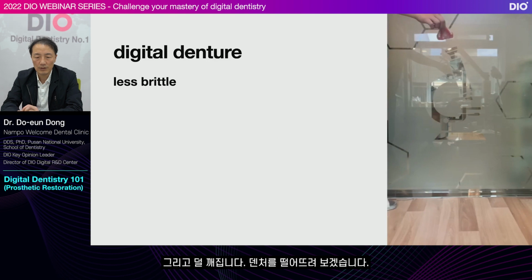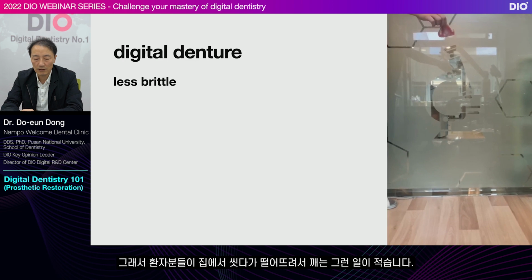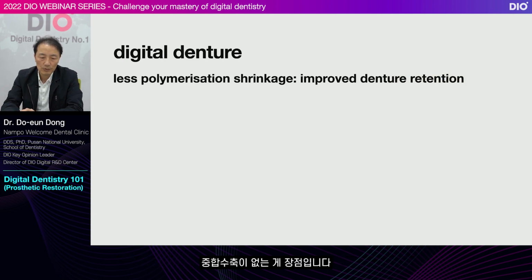It also breaks less. I'll drop a denture now. Even if you drop it, it doesn't break. So, it's less common for patients to drop and break it while washing at home. It's an advantage that there is no polymerization shrinkage. That's why the denture has good retention.